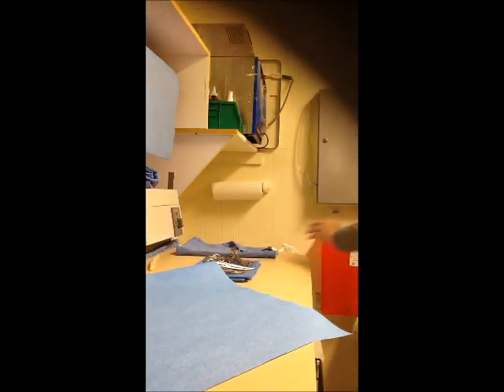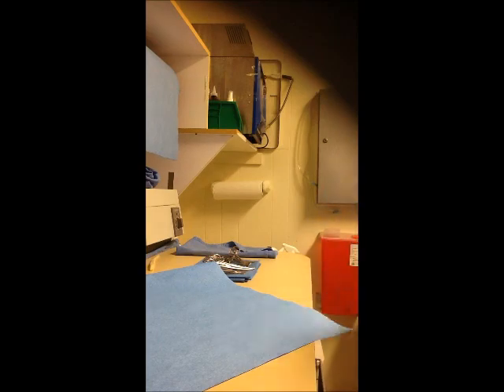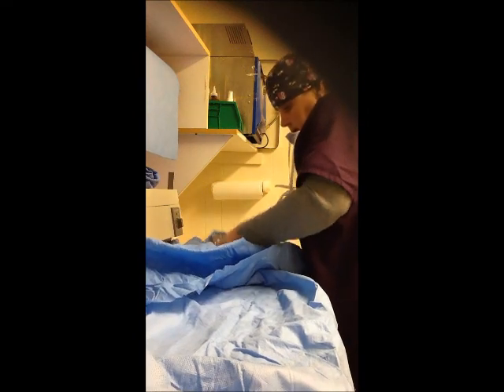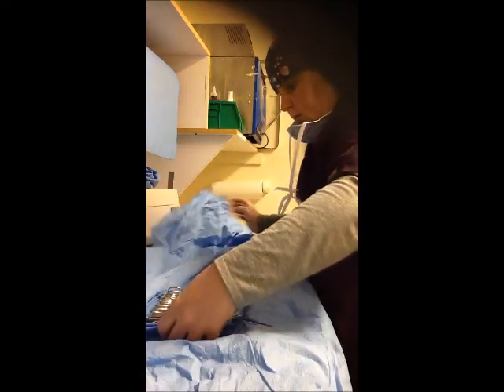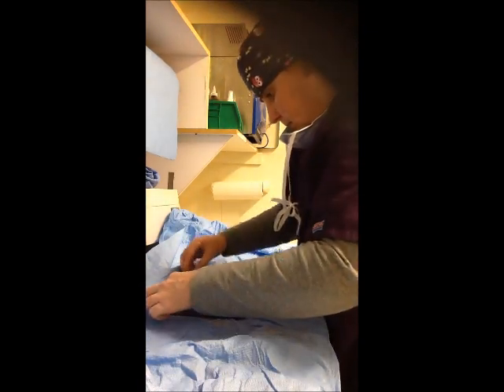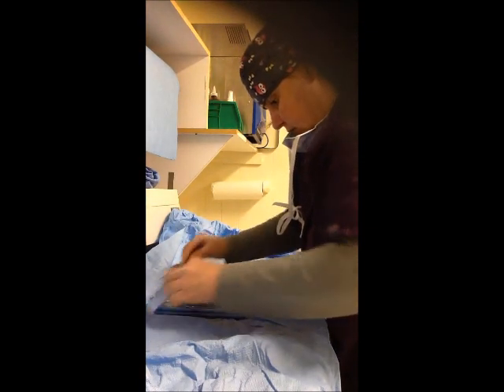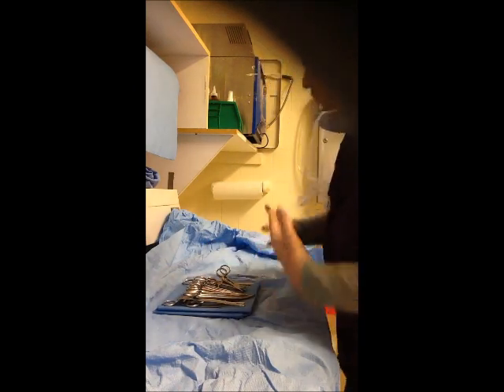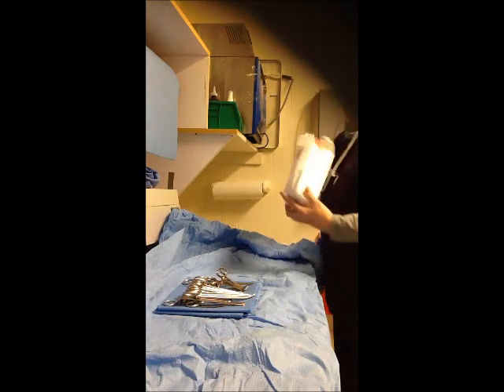And then take an outer surgical wrap along with our inside drape. And our drape goes down flat. Take these, we put them inside. Our biggest concern with all of the instruments is that they don't poke through to the outside.